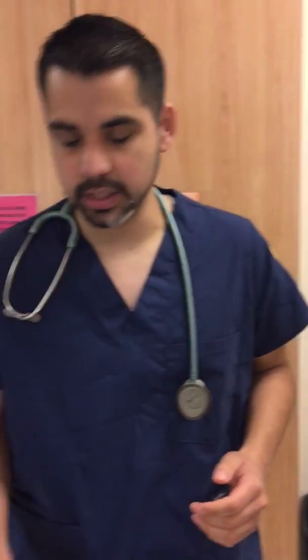Hi, my name is Christian, and in this video I'm going to be demonstrating how to give a medication through a small volume nebulizer. Alright, so before we begin, we want to look at the patient's chart and why it's indicated that this patient needs it. So I want to make sure that I look at the physician's orders, and right now it says to give 3 mLs of ipratropium bromide and albuterol, which is known as DuoNeb, to the patient.